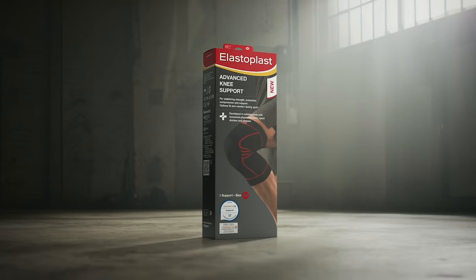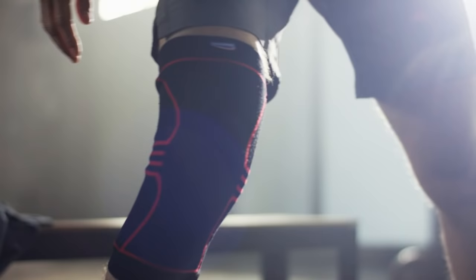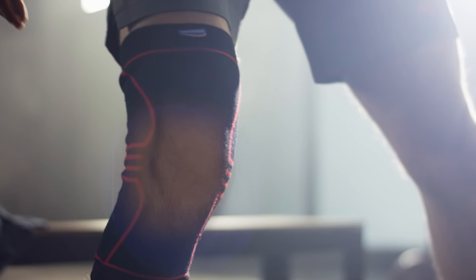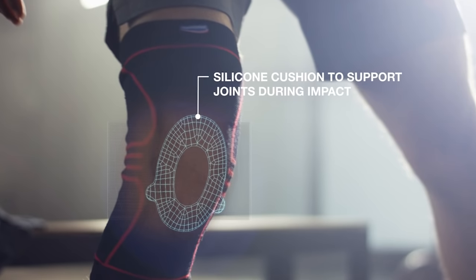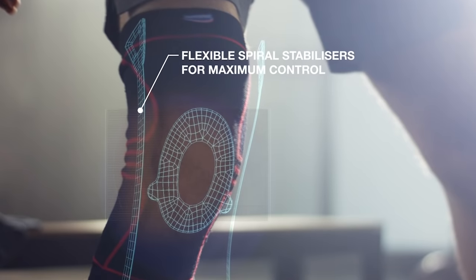Elastoplast Advanced Knee Support is designed to relieve pain and help prevent re-injury. With silicon waves to reduce slipping, a silicon cushion to support joints during impact and flexible spiral stabilisers for maximum control.